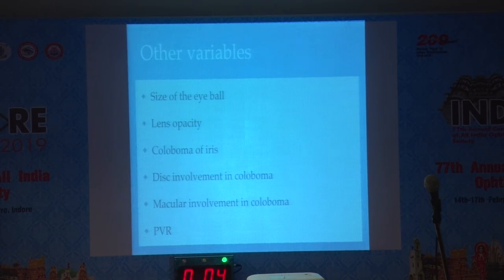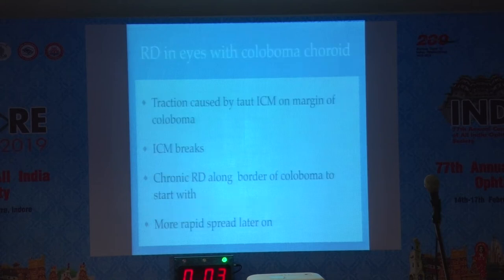So when we manage these cases, the variables we face with are the size of the eyeball, lens opacity, coloboma of iris, disc involvement, macular involvement, PVR. I may not be able to cover everything in 10 minutes time, but I'll quickly go over what we can.